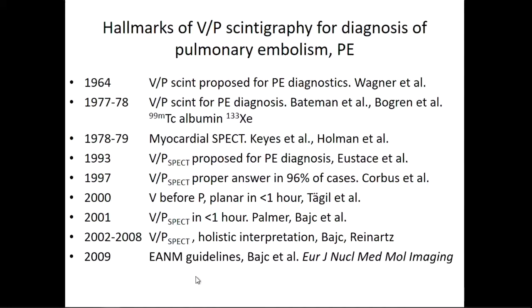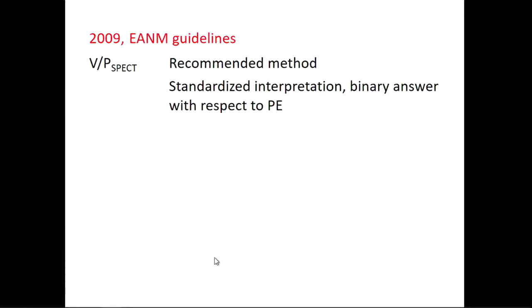And EANM guidelines, as have been discussed by Dr. Bike. These guidelines are important, I believe, and we are working, as Marika told you, on an update. We need one single method. We need to standardize it because, as I will come back to, we need large materials for research in the future. It means a standardized test with standardized recording and standardized interpretation.